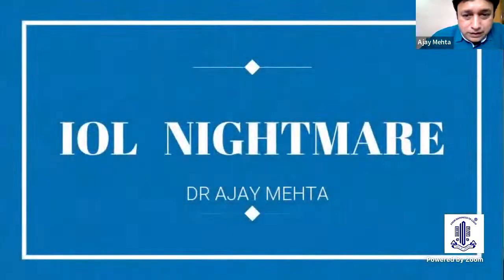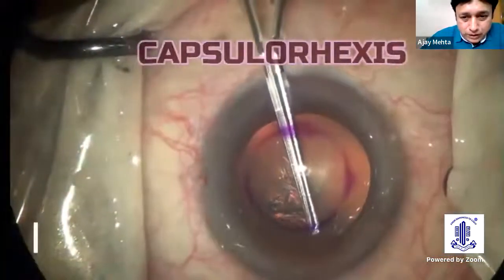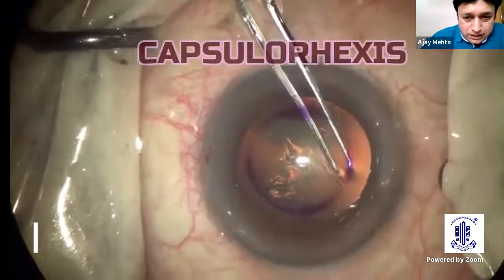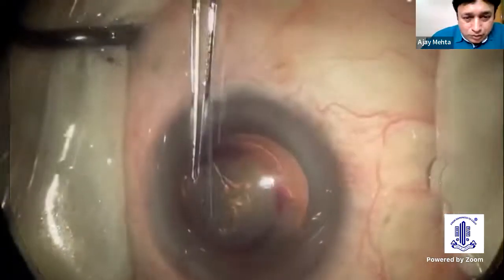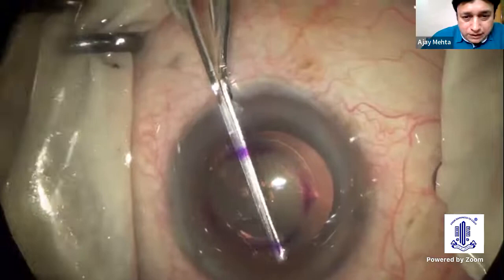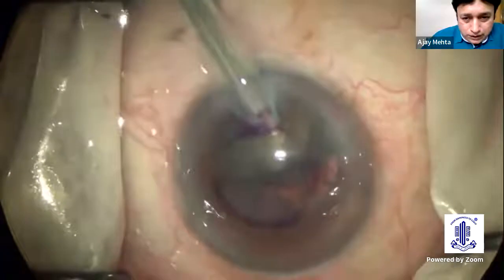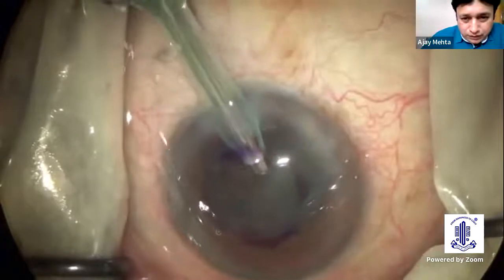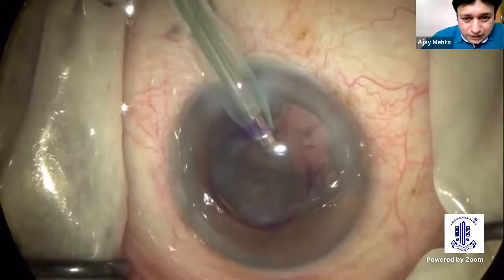So this case was a routine, important patient posted for cataract surgery. I marked the cornea for cataracts, and because this patient wanted the best lens, we chose a preloaded lens. We made a capsulorhexis, and phacoemulsification was carried out as we do routinely in medium hard cataracts. So far everything was uneventful, and I was happy that the patient had paid a lot, and I was going to give him back a lot.